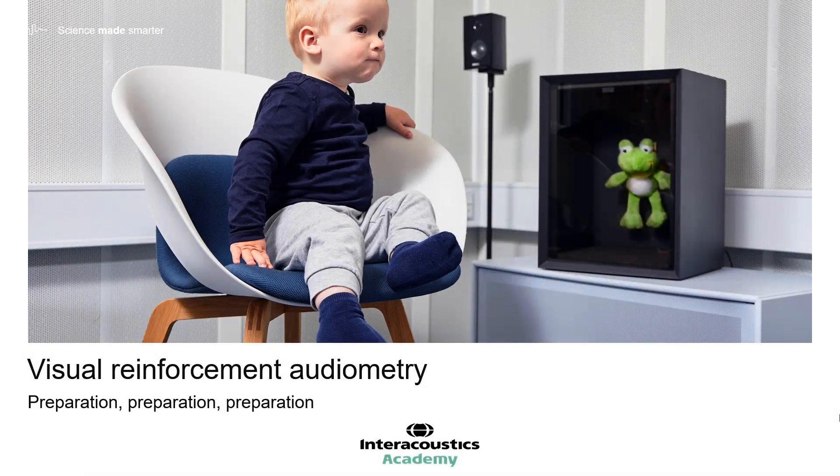There are some specific considerations for the setup and preparation of visual reinforcement audiometry. In this video, we will explore how to ensure the appropriate test environment, equipment setup, which toys to use, as well as how to prepare the different people involved in the test.